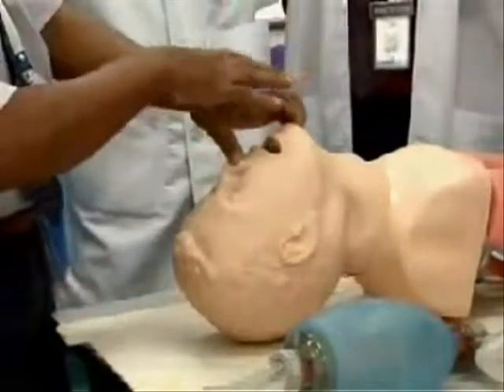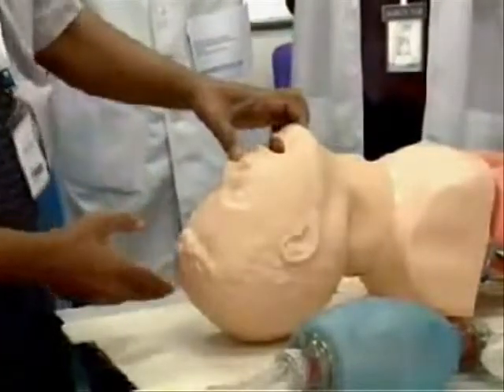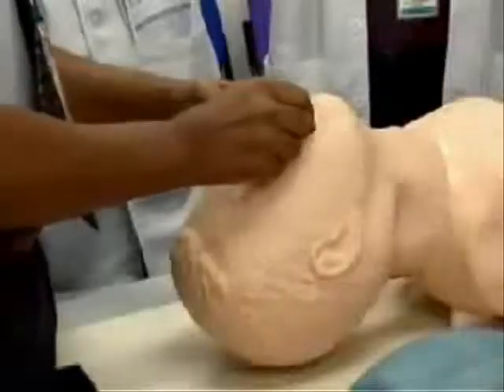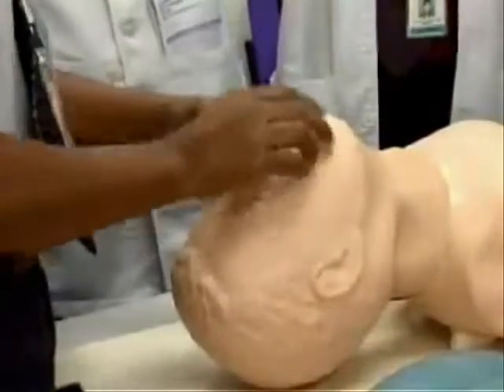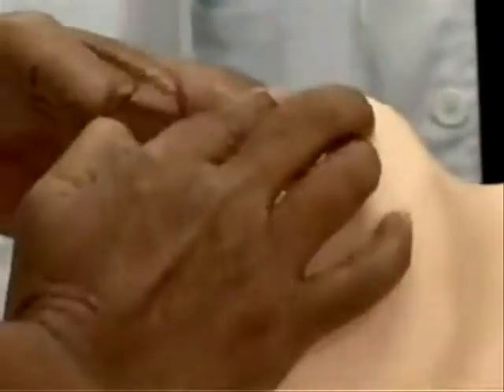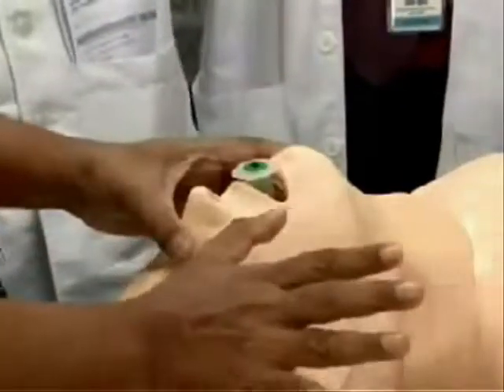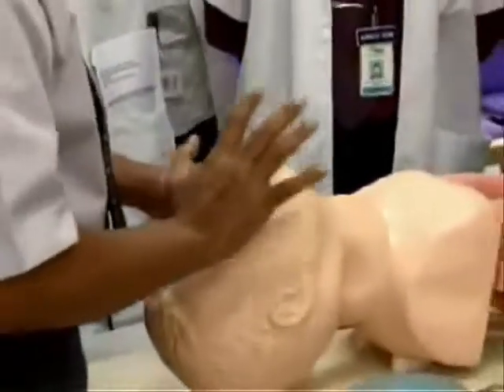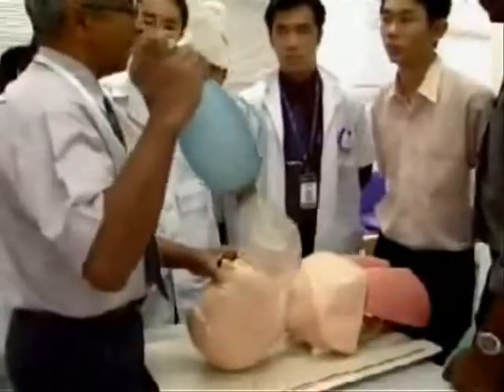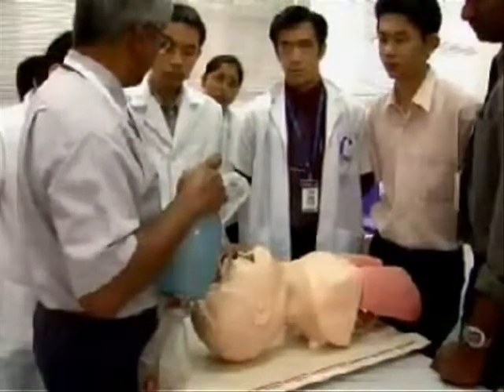If the maneuver is successful, you can observe the patient to see if breathing is fine. But if breathing is not fine, you have to perform bag-mask ventilation. Today, that is what we are practicing — bag-mask ventilation.